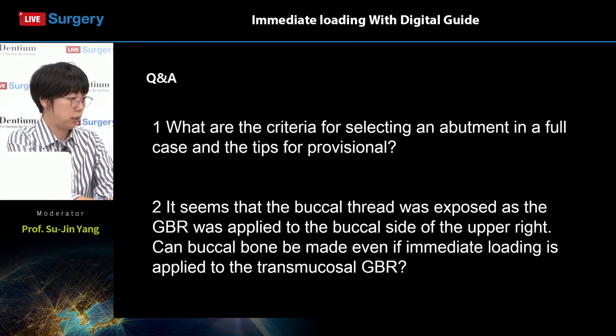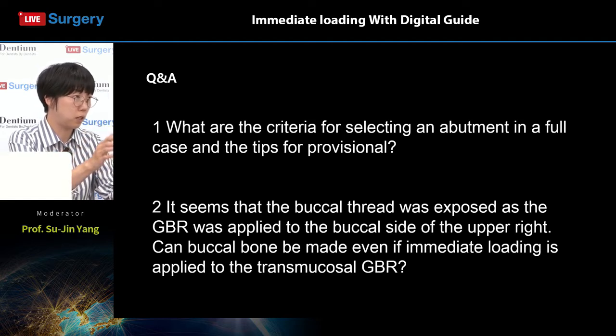Also, please make sure that your abutments match the crown height space and vertical dimension of the patient. It's critical that you have the concepts of fabricating complete dentures when you're doing a full mouth case. So please check your patient's jaw position, vertical dimension, everything that has to be processed before making dentures. The lateral guidance of your provisionals can differ according to the patient's status or the implant placement positions, but make sure that the posterior support is firmly established firsthand, very important.